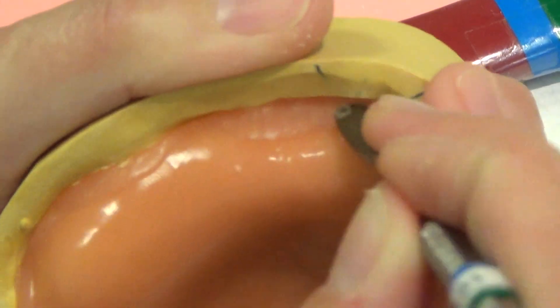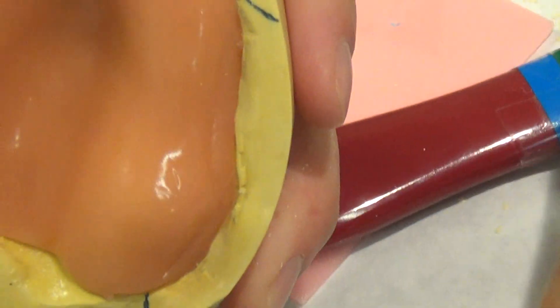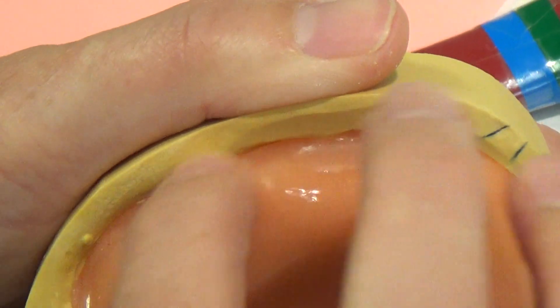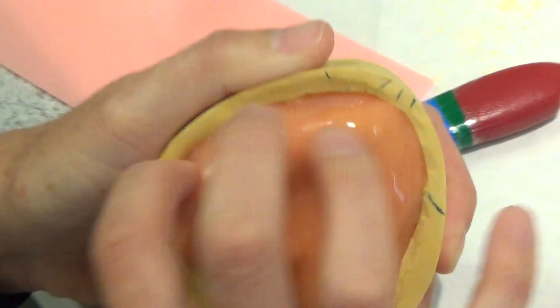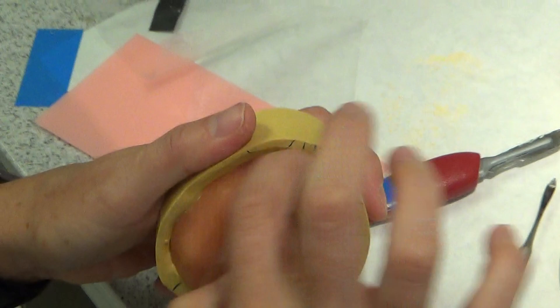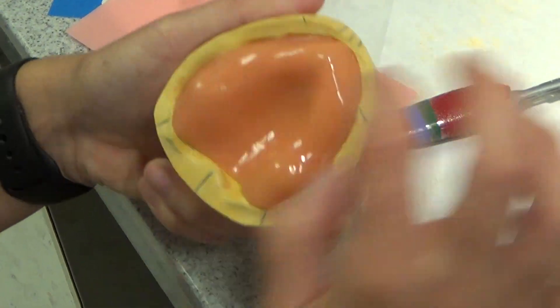This instrument will smooth it. A wet fingertip will smooth it. A little bit of Vaseline on your finger can help you smooth it. Vaseline is not going to hurt it as long as you don't use a whole lot.